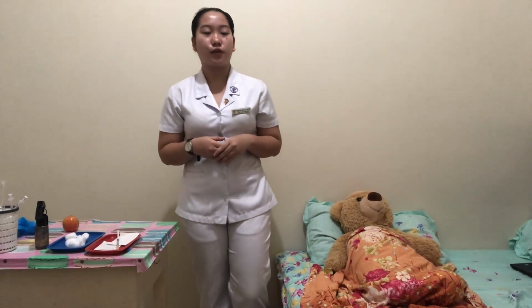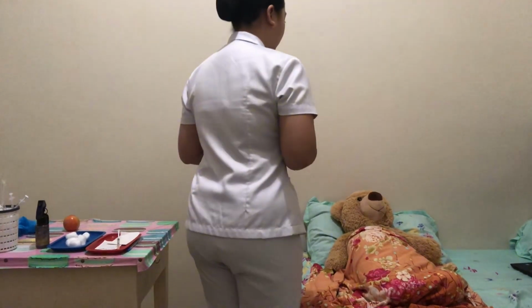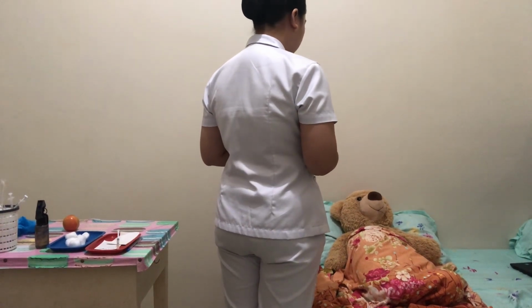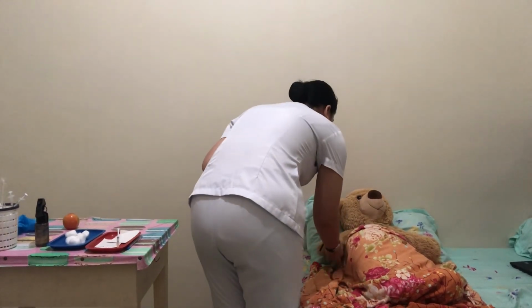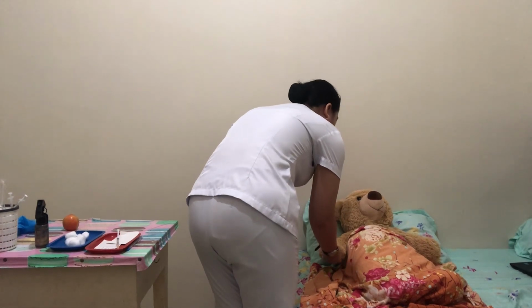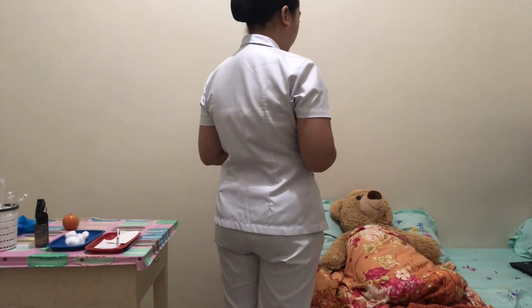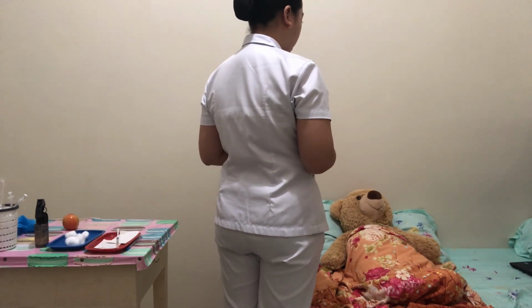And then I'll introduce myself to the patient, verify the patient's identity, and explain the procedure to the patient. Good morning, ma'am. I'm Michelle Jane Sibilia, your student nurse for today, and may I see your wristband, please? And can you state your name and your birthday? Alright. Ma'am, today I will administer an intramuscular injection. So your doctor has prescribed you with morphine sulfate to alleviate your feeling of pain, okay?